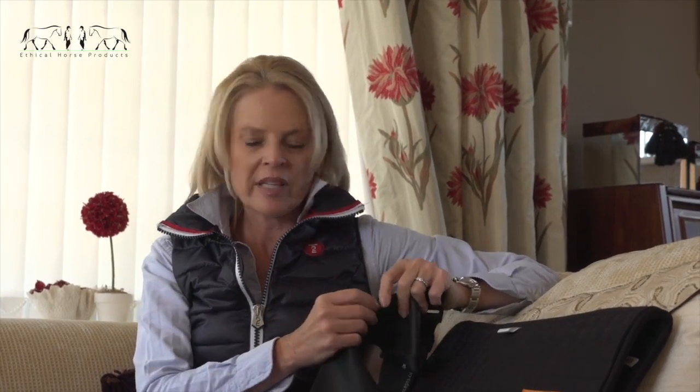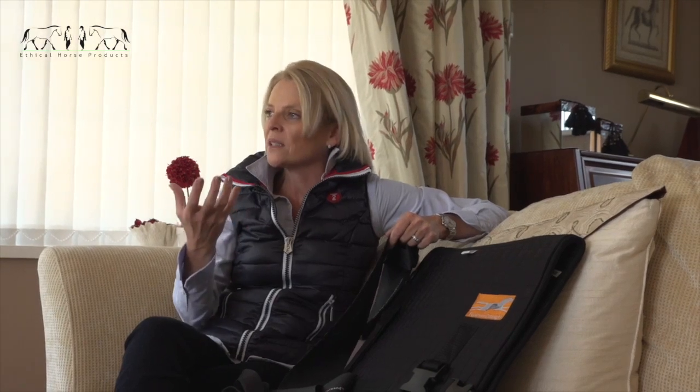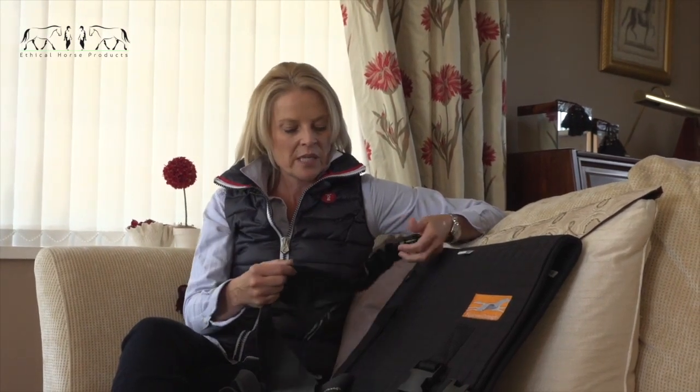And was that through observing the horses visually, or was that through measurements, objective measurements? Both, essentially. We played with the different thicknesses, so the differences in resistance. If it's too light, the stimulus isn't, how can I say, effective enough. So essentially the band would slide, but you could see that it would provide a little proprioceptive input.